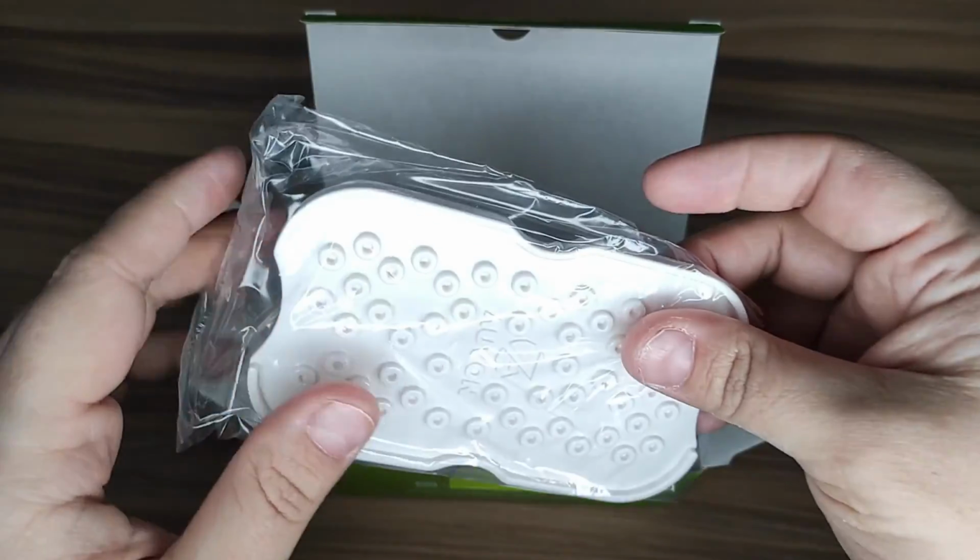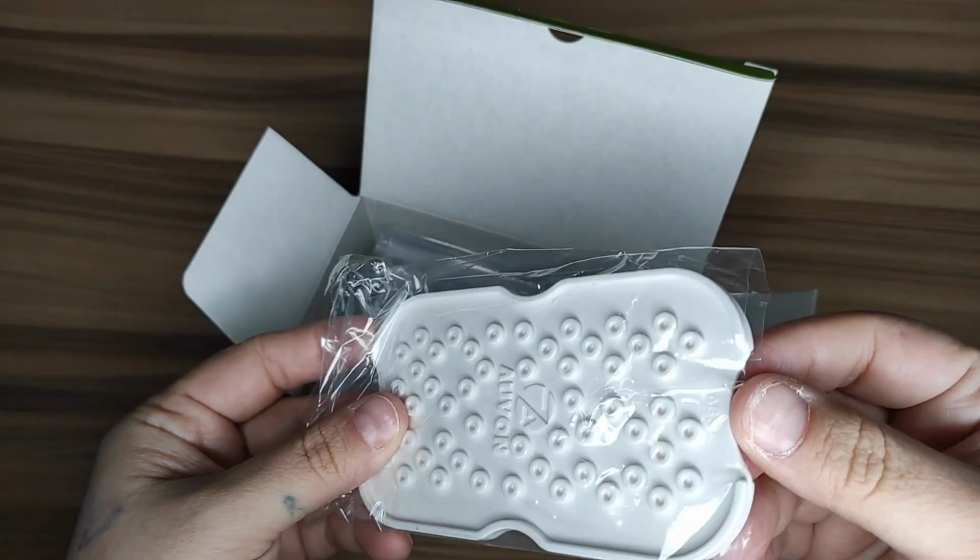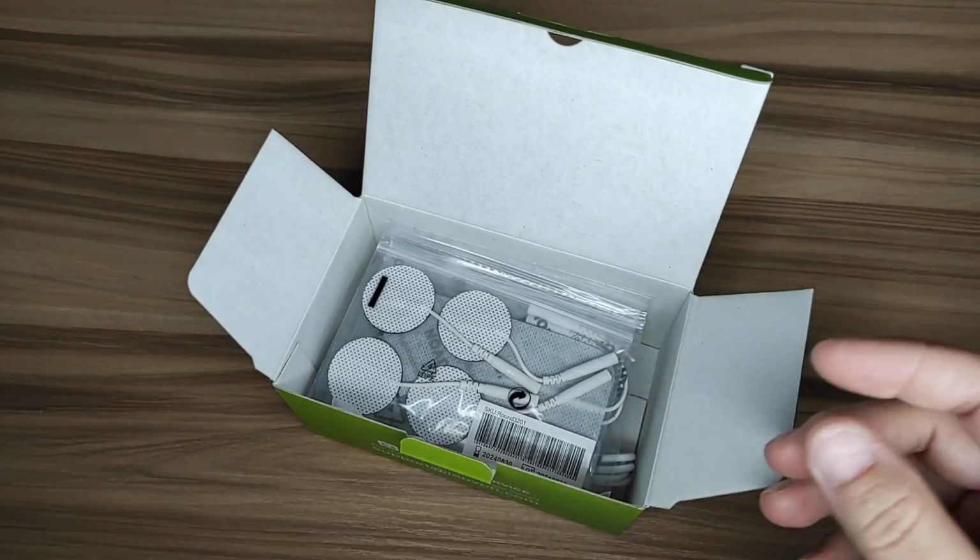And this thing right here is where you can put your pads. You can stick them to it, so whenever you want to use it again, you don't have to pull them off the little plastic. You can just stick them to that.